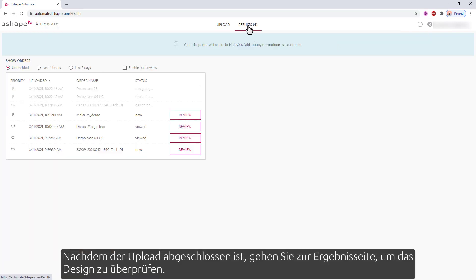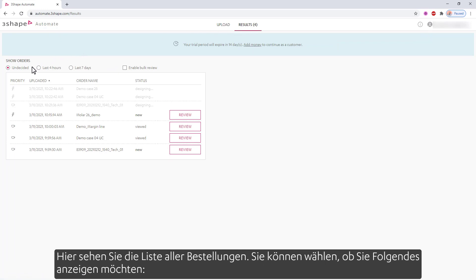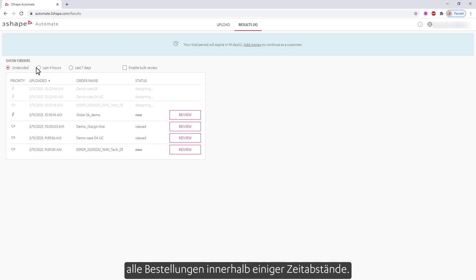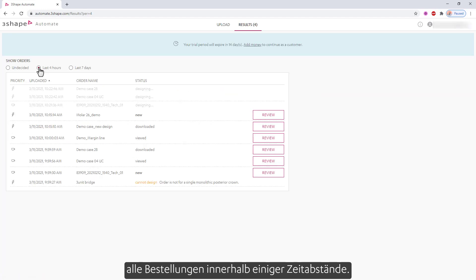After upload is completed, go to the results page to review the design. In here, you'll see the list of all the orders. You can choose to view undecided orders — these are orders that the service has newly completed and that you have not viewed before, or orders that you have seen before but have not made a reject or accept decision on.